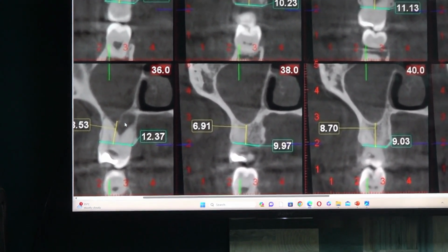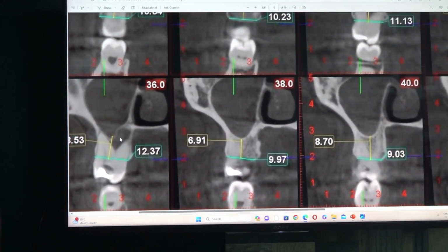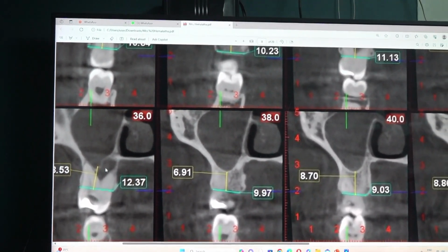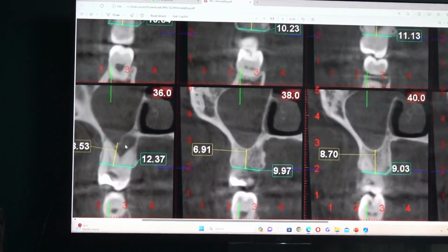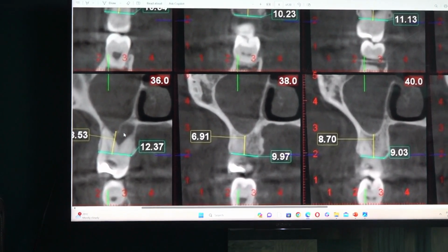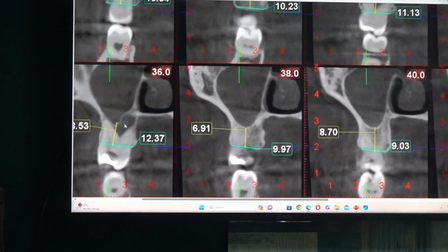After extraction, see the tooth. If there is periapical granuloma, you don't have much to curate because the granuloma has come along with the tooth. If nothing is there on the root, then the granuloma is inside, the periapical infected tissue is inside. So you have to curate gently. You can place a 5.5, 10 or 12 in the palatal socket.